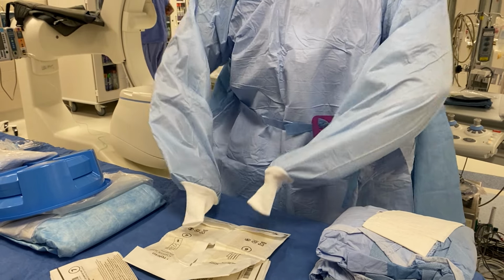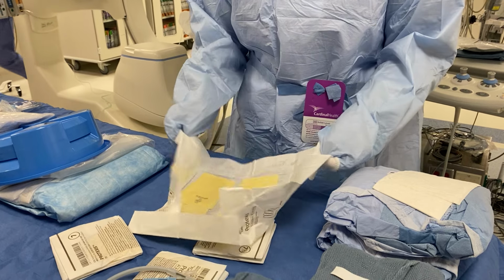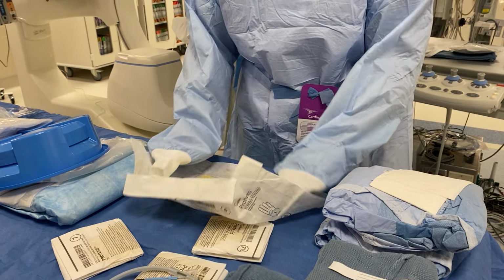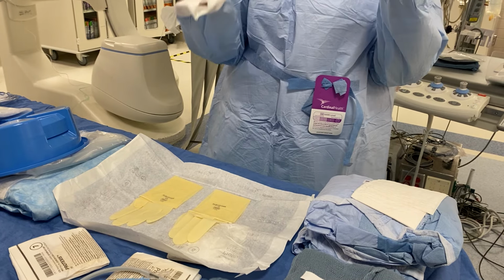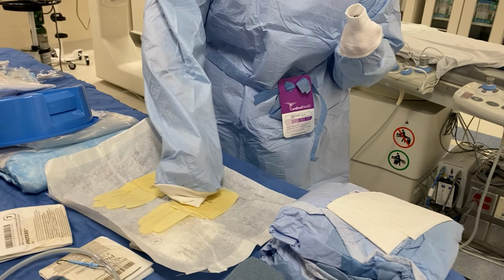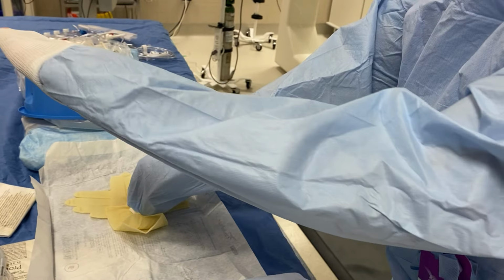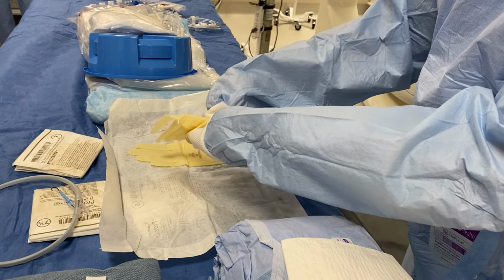And I'm doing everything with my hands still inside the sleeves. I'm going to open up the packet of gloves, and I'm going to start with putting the left glove on. So what I'm going to do is reach inside the glove to open it up, slide my hands out just a little bit, and slide my hands right in.